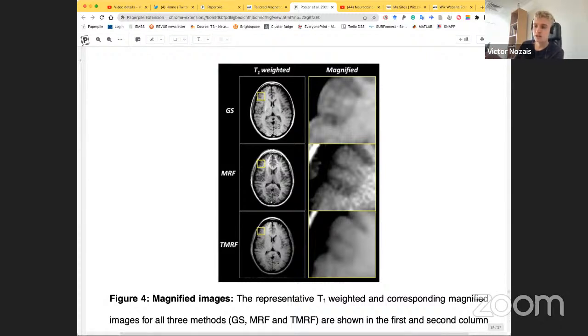Usually the metric is higher on better images, but in this specific case the algorithm finds a way to maximize it without actually making the image much better. It can be a bias, but that's just deep learning stuff that you have to be careful about. And I don't know how they did it here. So I'm just saying this.